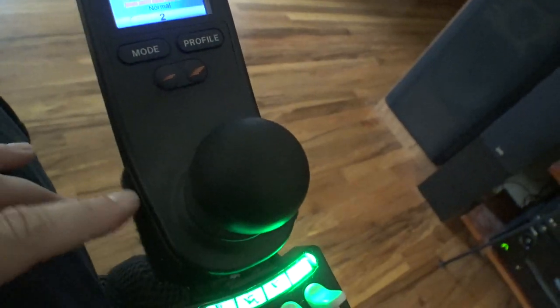The way Permobil has these things set up from the factory, they want you to have an external switch attached that's used as an emergency stop — and not just any external switch, it has to be a normally closed switch. When you go into that mode, you have to push that button so the system knows it's connected for safety. Typically those are going to be set up with a chin switch or a remote head switch. But in their documentation, there is also a setting you can change to override all of that so you don't need an external switch at all.